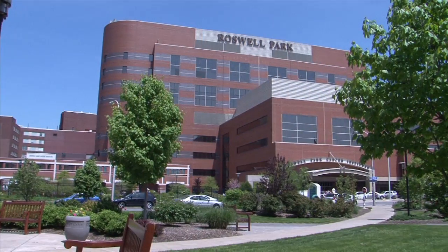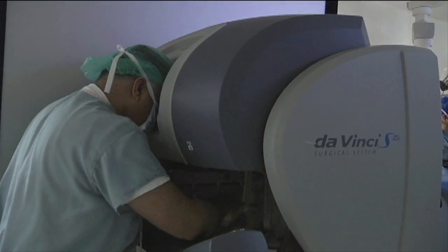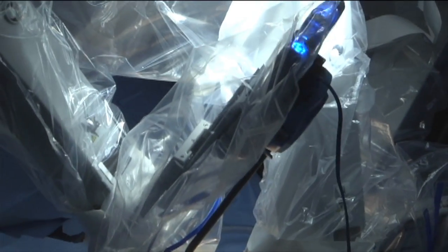At Roswell Park Cancer Institute, Dr. Khurshid Guru uses advanced robot technology to assist in delicate surgery. He operates the robotic arms from a corner of the room, using computers and magnified images to guide tiny instruments inside the patient's body. The only clue you get when you operate on a robot is a visual clue. So the only thing you can do is see.